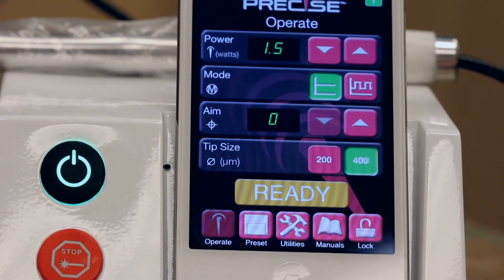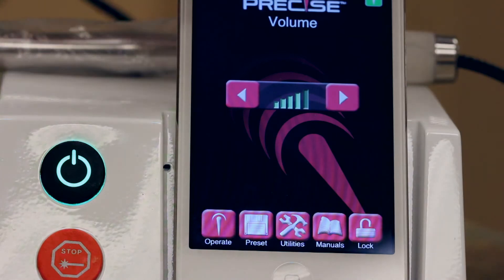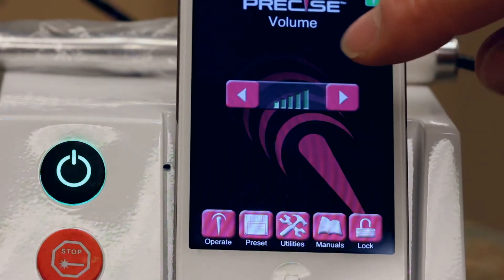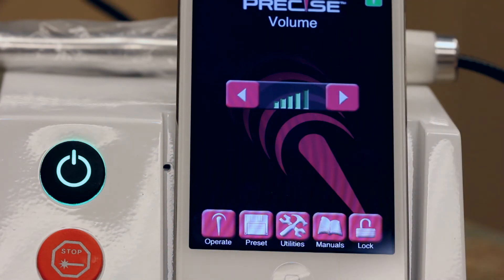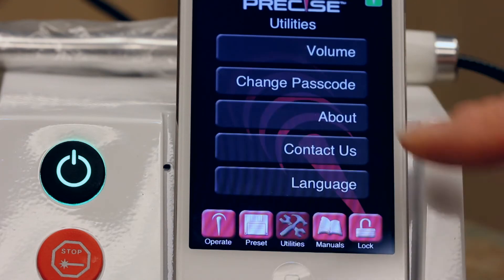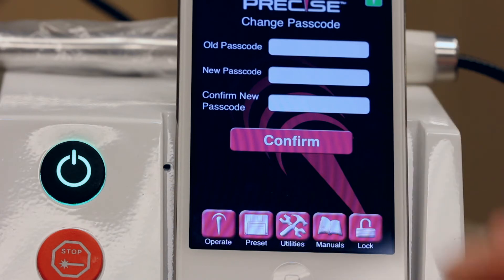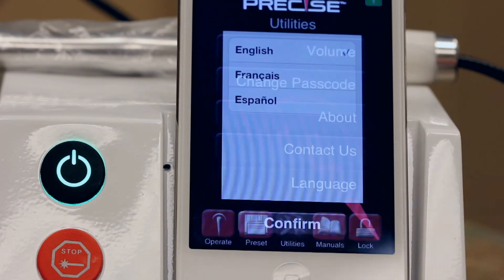The SHP allows you to adjust the volume of the beeps and tones that the laser makes, so you can hear these signals without it being overly intrusive or distracting to the patient. If you haven't already done so, please change the passcode from the factory setting to a passcode of your choosing. The passcode serves as a lockout key to prevent unauthorized people from gaining access to the laser controls and firing the laser.